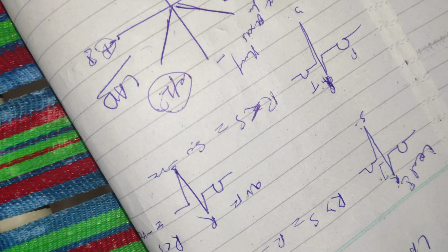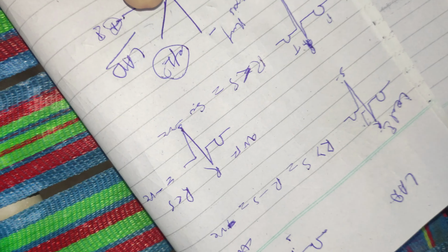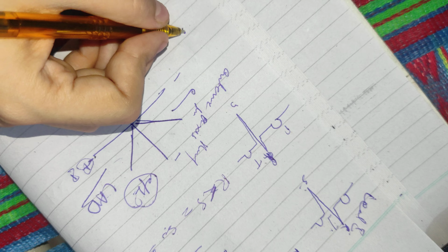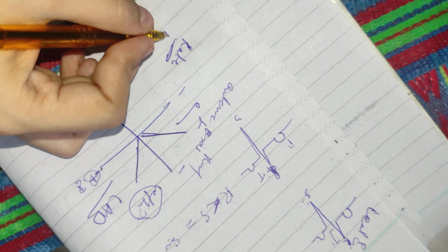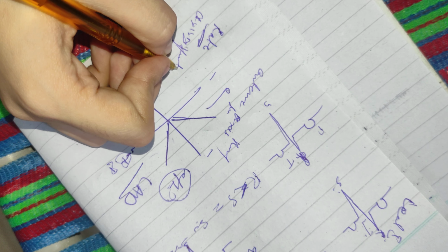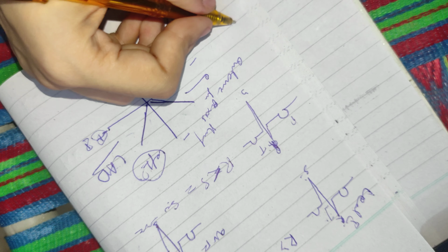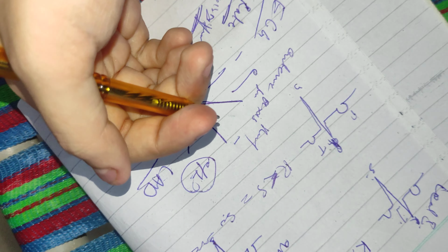Basically I know I might have mixed up the things, but there is no need to go so much in depth in ECG if you are at undergraduate level. This is my personal point of view. So basically you should have a good finding and rate. Then finding axis deviation is not much difficult if you do good research and try to understand. It's not very difficult. Then you should further understand the few or more complexities of ECG, but don't go too deep, especially into the calculated parts that make ECG so difficult.